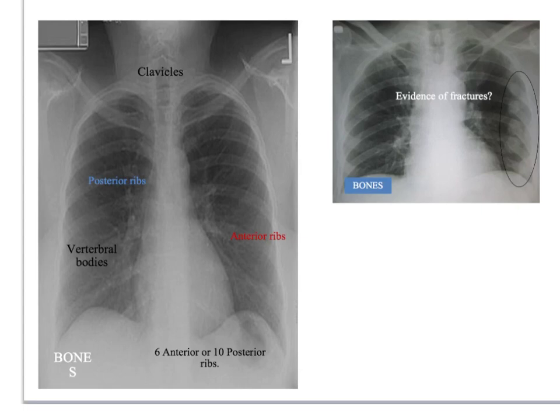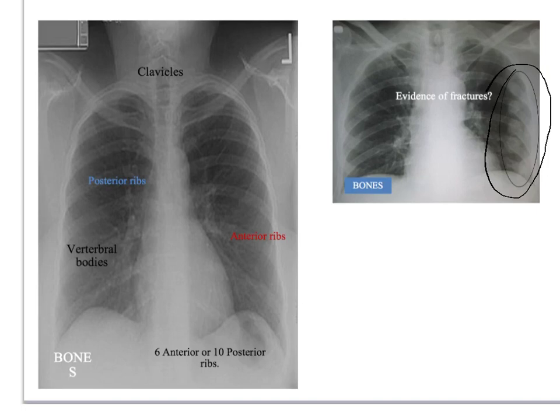Having done airway, we move on to B for bones. We look at all the bones visible in the chest X-ray — the clavicles, scapulae, heads of the humeri, ribs, and vertebral bodies. You examine them for fractures, as visible here, and also for metastatic changes or darkened areas. You should also count the ribs: you should see a maximum of six anterior or ten posterior ribs. If you can see more, you may be dealing with a hyperexpanded lung, as expected in someone with COPD.